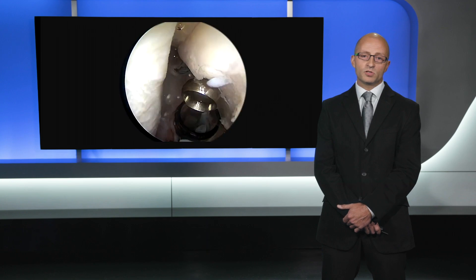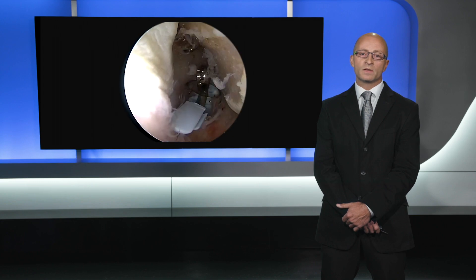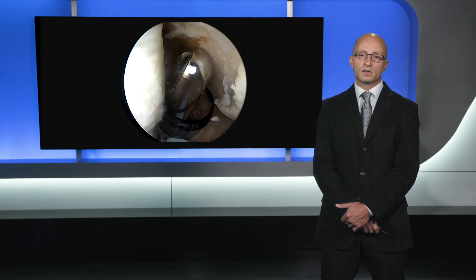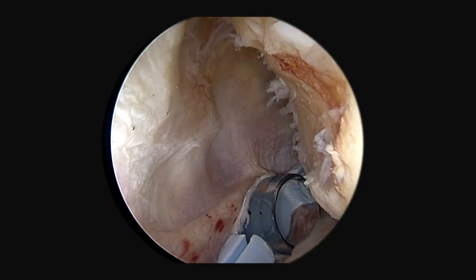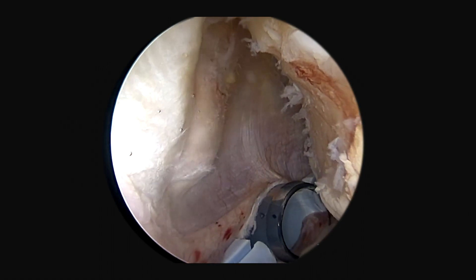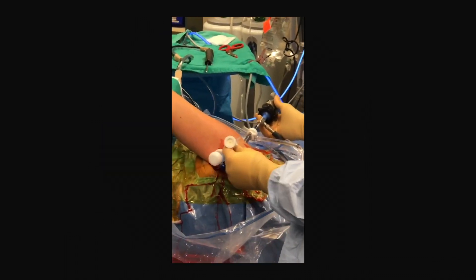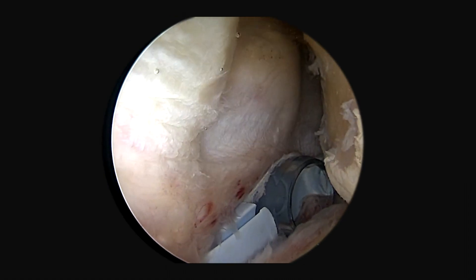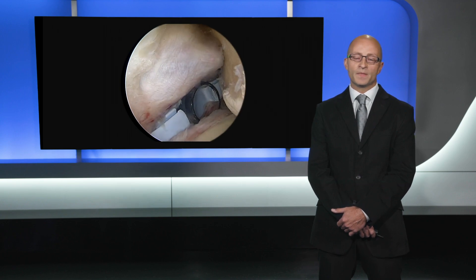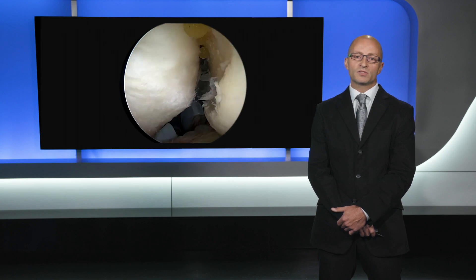I placed a Gemini cannula posteriorly. I like this cannula because I can pull the soft tissue posteriorly and really create a space. I'm first going to curette the defect to create a good base for healing. Next, I'm going to insert the remplissage anchors. I use a spinal needle to locate where I want to place my anchors, then insert a threaded cannula and swirl it around to create space in the subacromial area beneath the deltoid, without going all the way through the soft tissue.